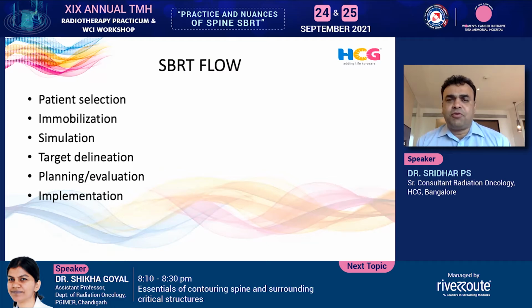So the SBRT flow is not different from any other radiation treatment. The patient selection is the key. We have already talked about that. How to select a patient for a particular SBRT spine, and immobilization techniques, simulation, target delineation, planning, evaluation, and implementation. Each step is important.